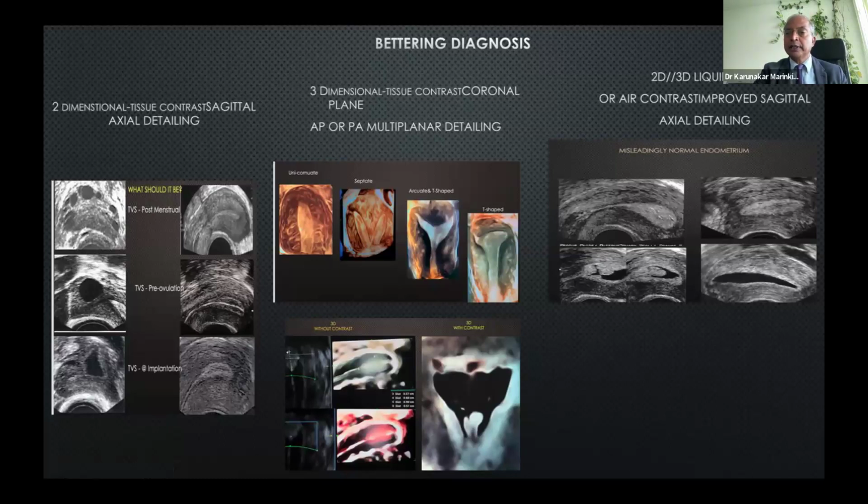And if the embryo is lucky, it can implant on a flatter area. I'll take a laser pointer here. So as you can see, in a flatter area, it may be lucky and implant. If it implants on the polypoidal endometrium, which you cannot see in a simple 2D scan, you have no way of saying, so it becomes a pot of luck. Whereas on the other hand, the same luteal phase looking endometrium, it doesn't matter the endometrial thickness, is a homogeneous luteal endometrium. You can see there are no endometrial pathologies and no uneven growth of the endometrium. So that's the endometrium that you want.